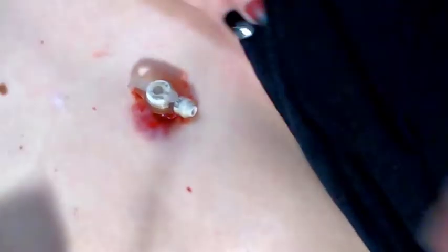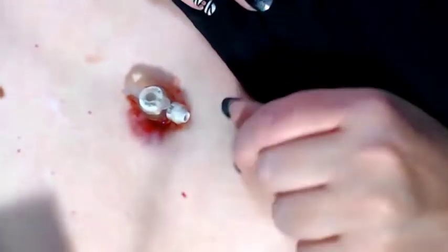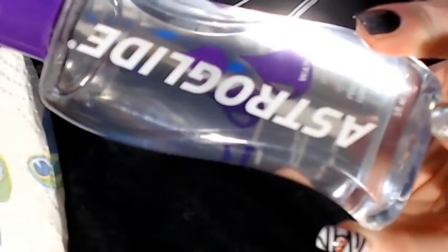So that definitely tells me that it's time to change it out, because what happens is that your stomach acids eat away at the tube in there, and yeah, it's gross. Alright, so I'm going to pull it out, and it's going to be a little painful. The thing that I forgot to get is the lube, because you need this on the new tube when you're trying to put it back in.